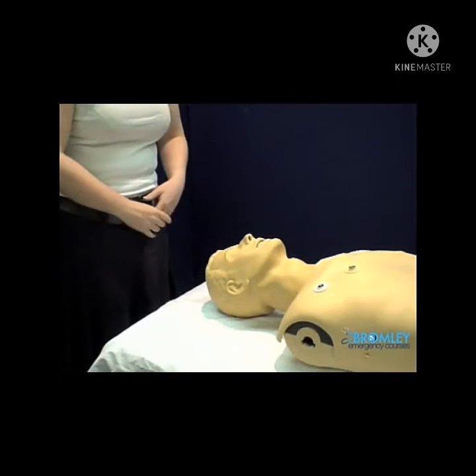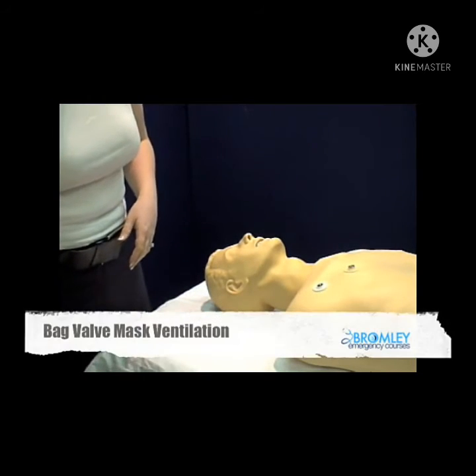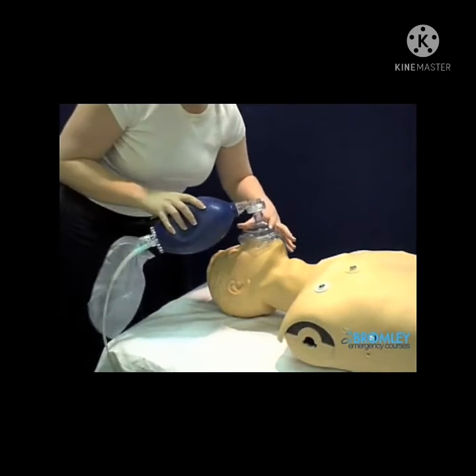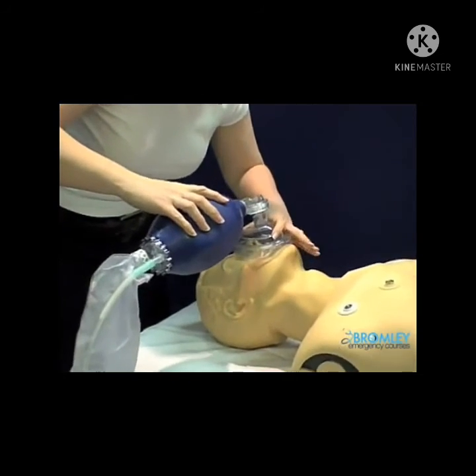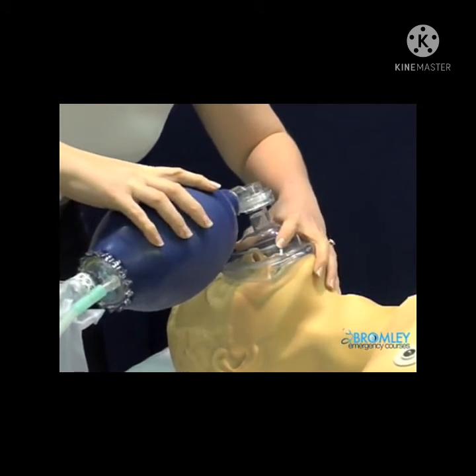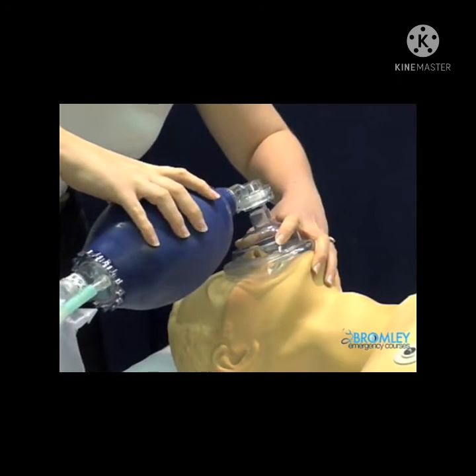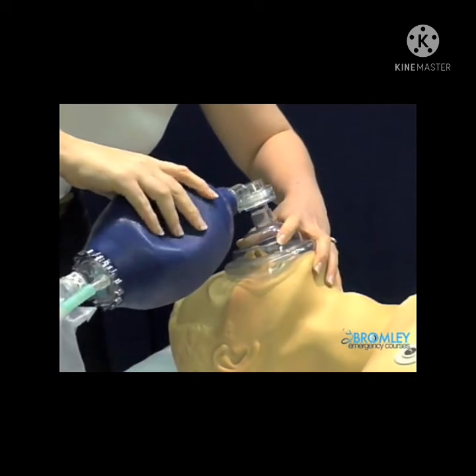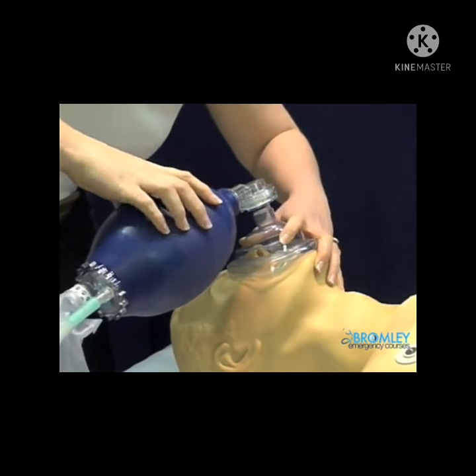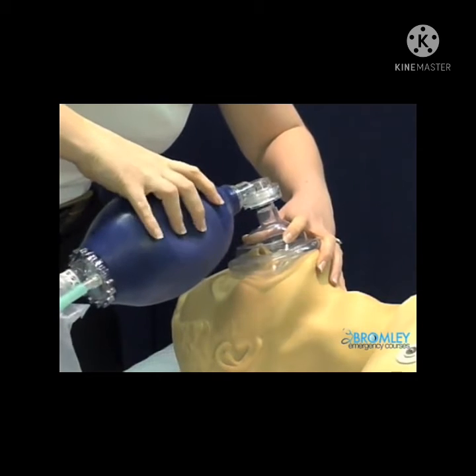The patient appears to have stopped breathing, so we are now going to need to ventilate the patient using a bag valve mask. It's possible to use a one-person or two-person technique. Ensure you have a good seal and that the airway is open. And ventilate. It's important to ensure that you're getting ventilation by looking at the chest. Alternatively, you could get someone to listen. Now, ideally in this situation, we would want to achieve a definitive airway.